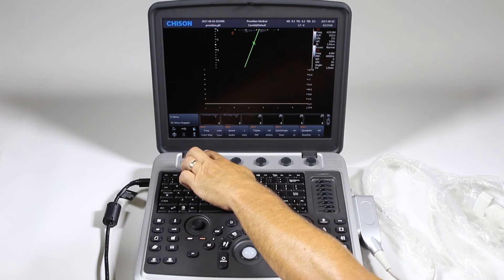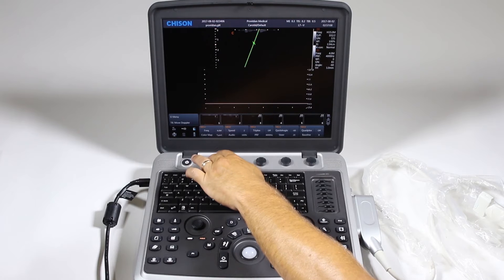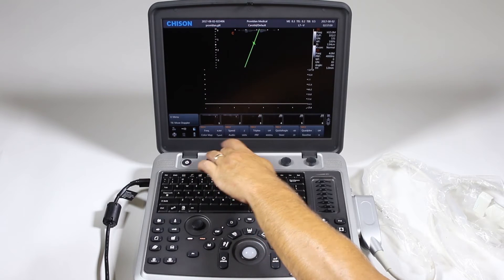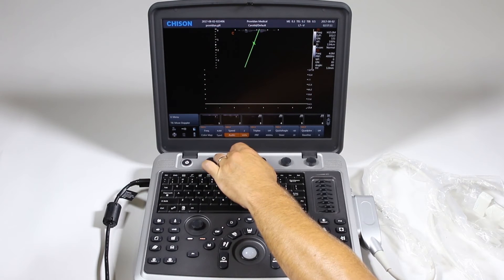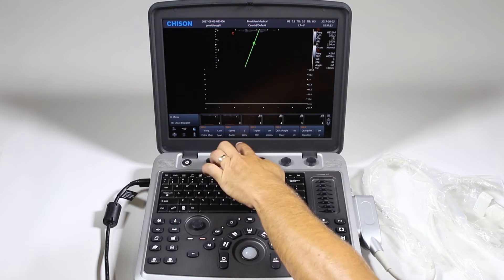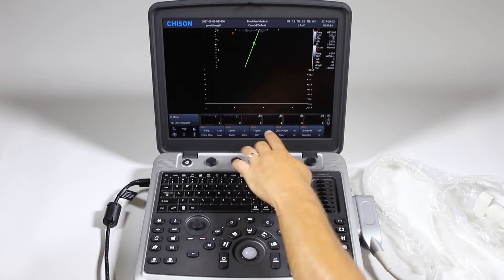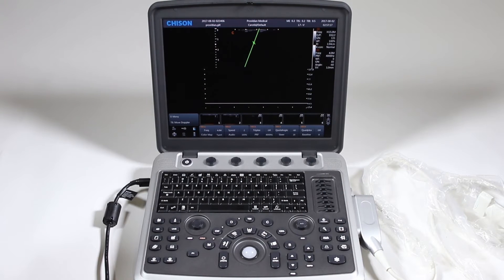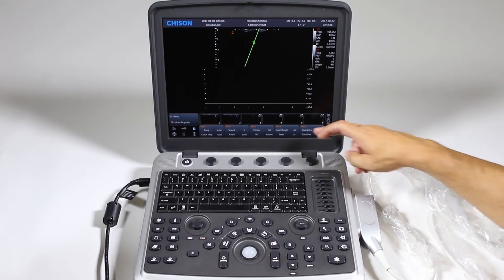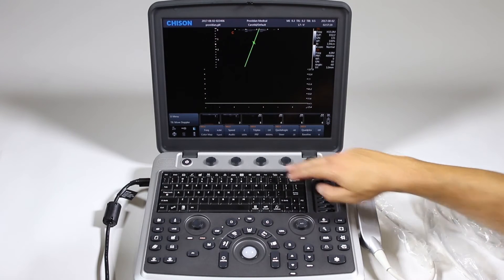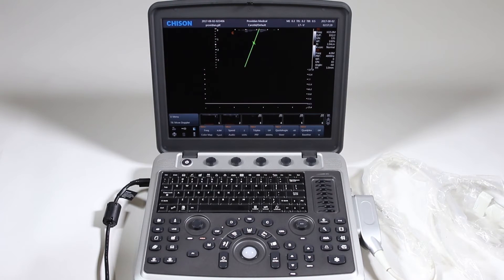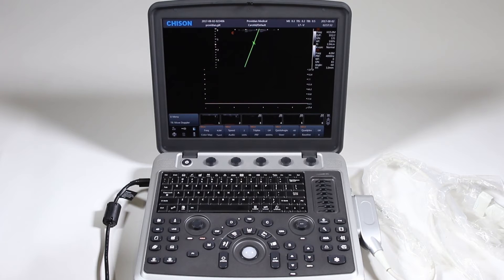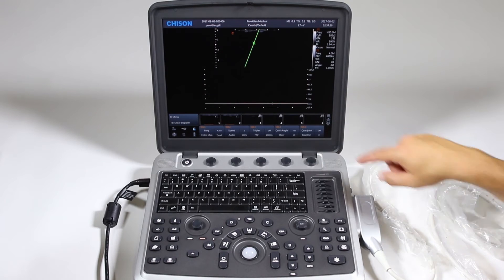Here's our Doppler frequency, our color map if you are in color, sweep speed, volume here. Triplex if you are doing Doppler and color mode. Pulse repetition frequency is what you'll use to change the velocity scale to avoid aliasing in high velocity mode. Show the quick angle and the steer.